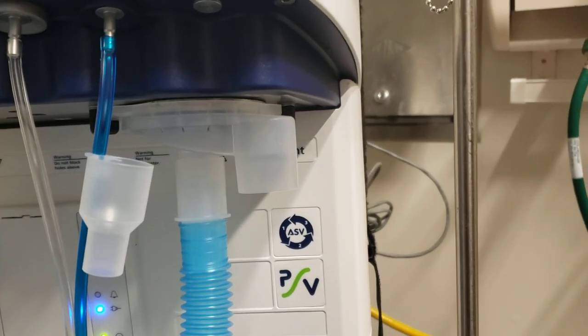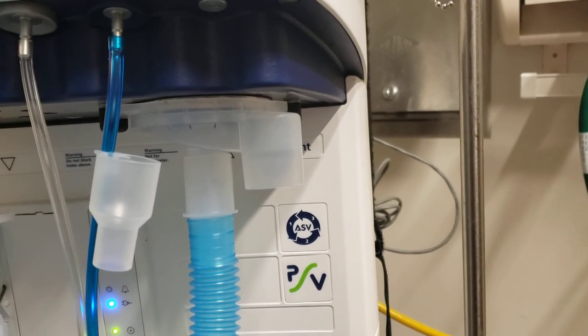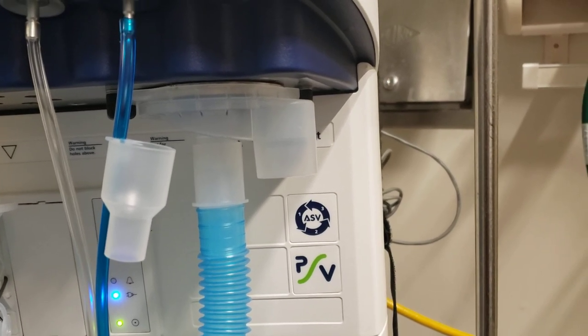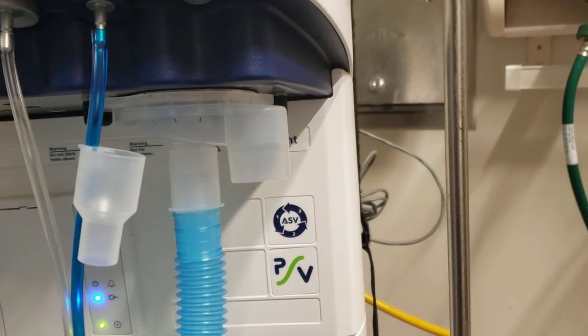So hopefully, if when it comes to it, if we end up running out of filters and we have a national shortage, this would be an effective means of taking that gas out of the room and keeping your staff safe.